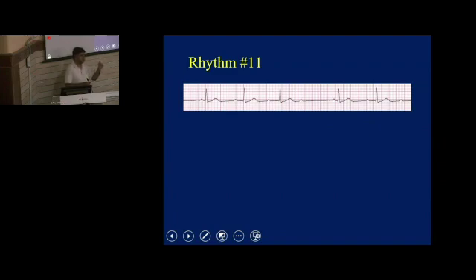Second thing we see is, what about the rhythm? Occasionally, only here we can see some irregularity, otherwise it is regular. Then third thing is sinus. Is it sinus rhythm? Yes. There is a normal P wave followed by a QRS complex. So it is a sinus rhythm. That means it is important. That means rhythm is being generated from normal pacemaker, that is SA node. So this is normal. Then coming to the PQRS T waves. They are all normal. All waves are normal. P wave is normal, QRS complex is normal, T wave is normal.